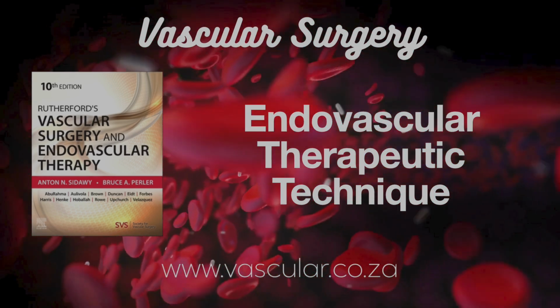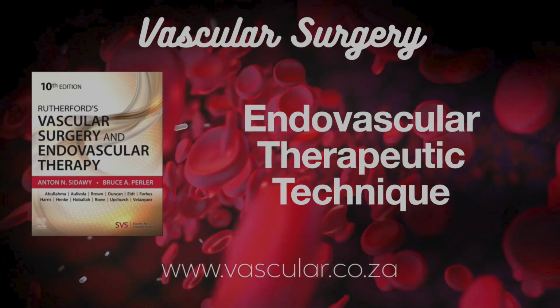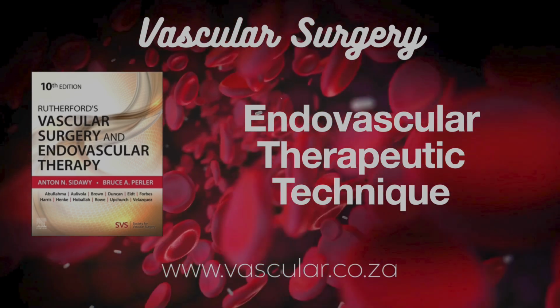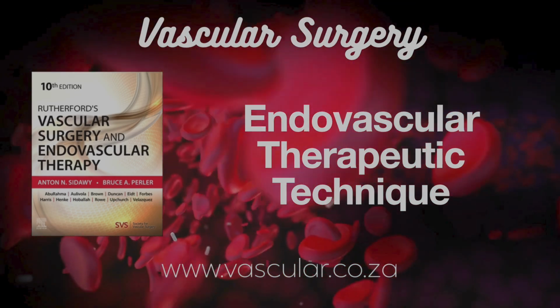And finally, laser atherectomy. What kind of laser? How does it work? Typically an excimer laser, specific ultraviolet wavelength, 308 nanometers. It ablates plaque and thrombus through photochemical ablation, basically vaporizes on direct contact. Supposedly minimal thermal damage to surrounding tissue.